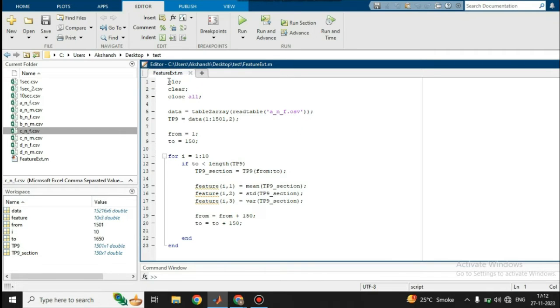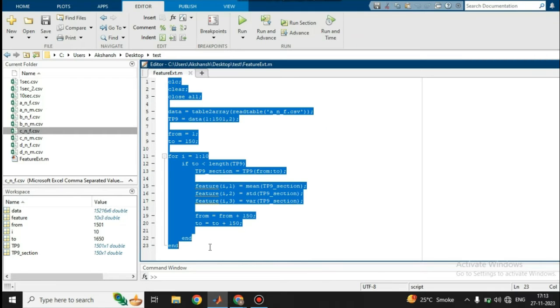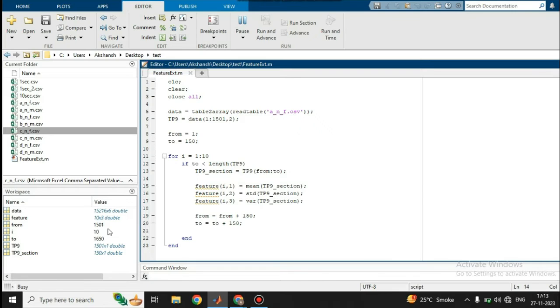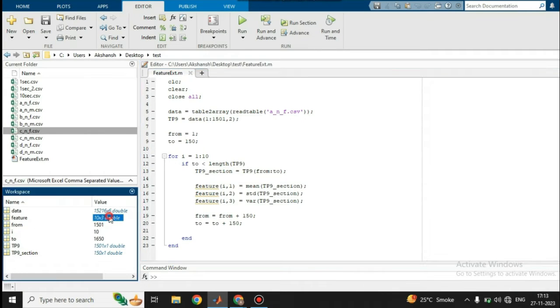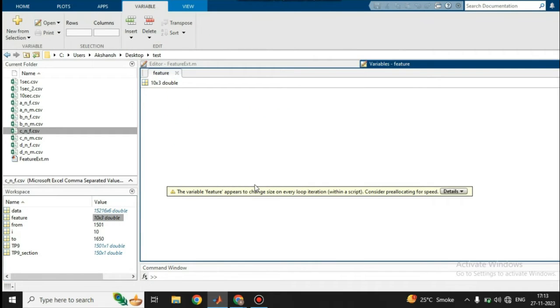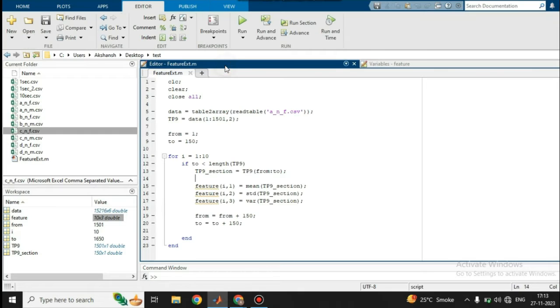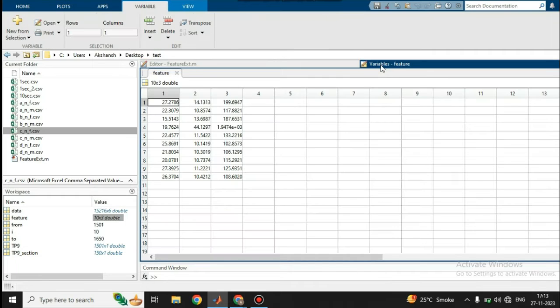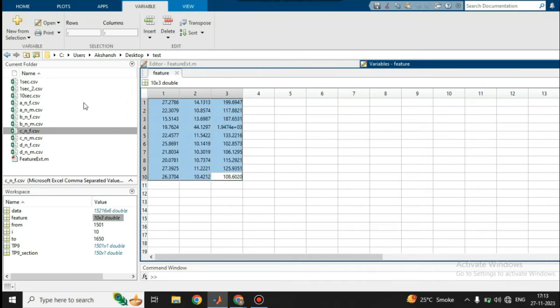This is the code that we wrote in part 2 of EEG signal analysis. We'll quickly run this code and here we have the result. The result we are receiving is the feature. We were calculating three different features: mean, standard deviation, and variance. This first column represents the mean, the second is standard deviation, and the third is variance. This is the feature matrix for just one CSV file.